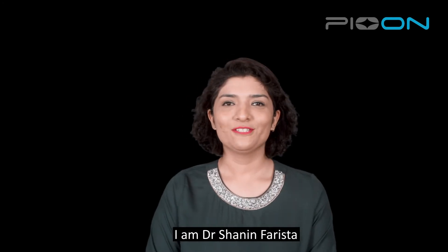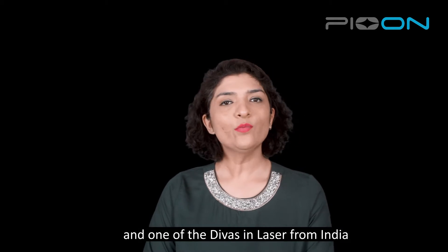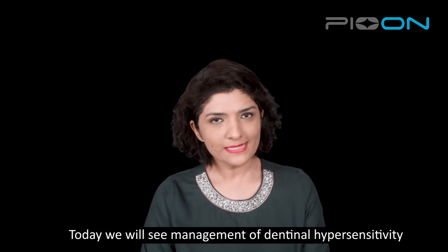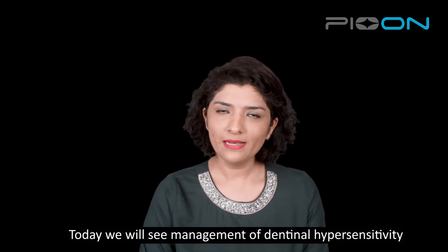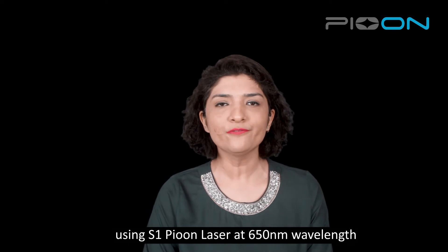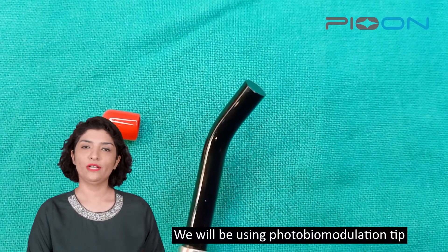Hello everyone, I am Dr. Shannon Farishta, endodontist and laser specialist and one of the diverse lasers from India. Today we will see management of dentinal hypersensitivity using S1P laser at 650 nanometer wavelength. We will be using the photobiomodulation tip.